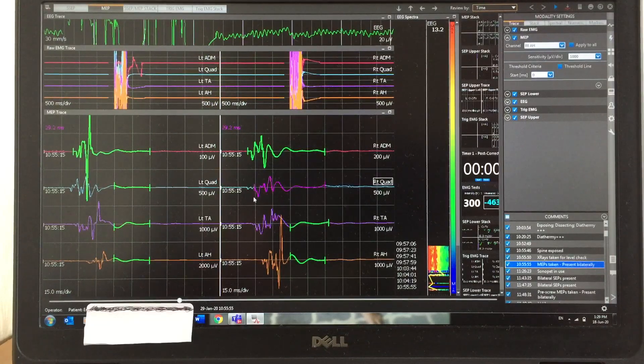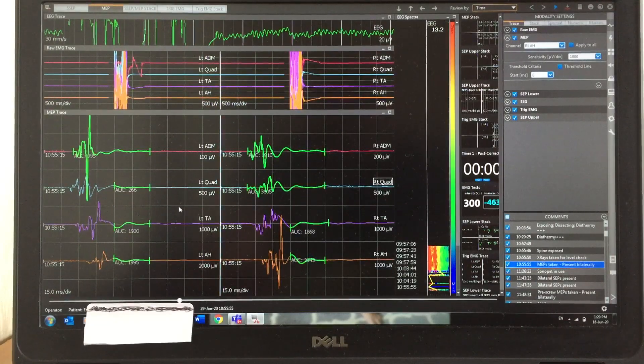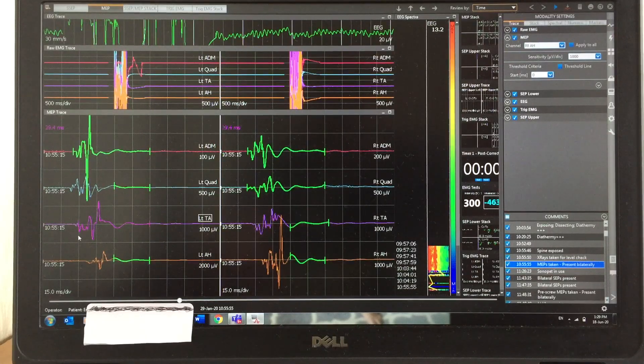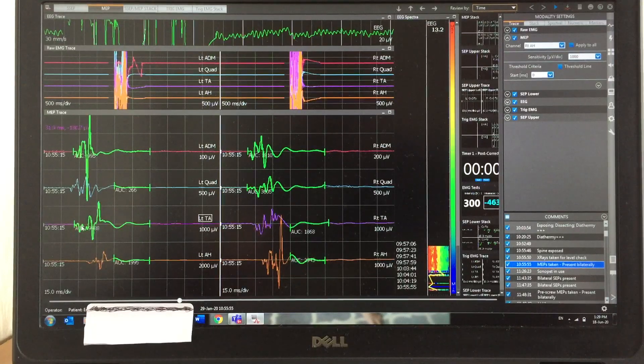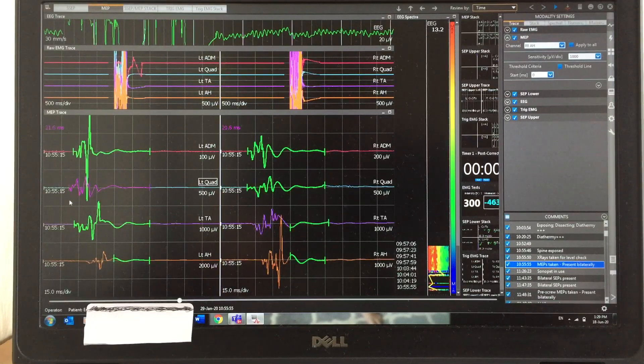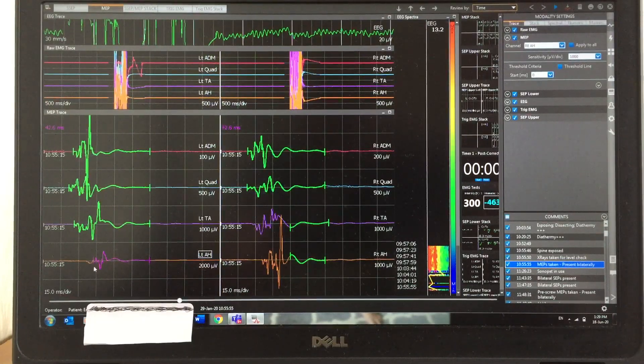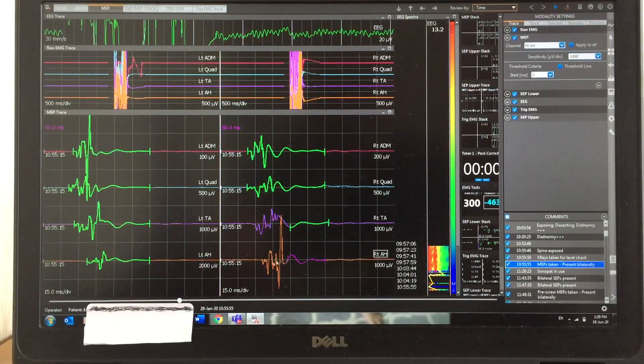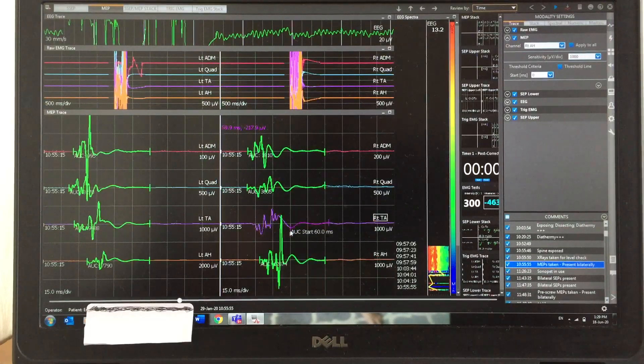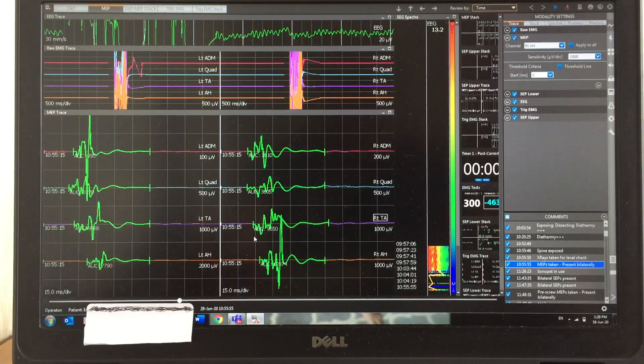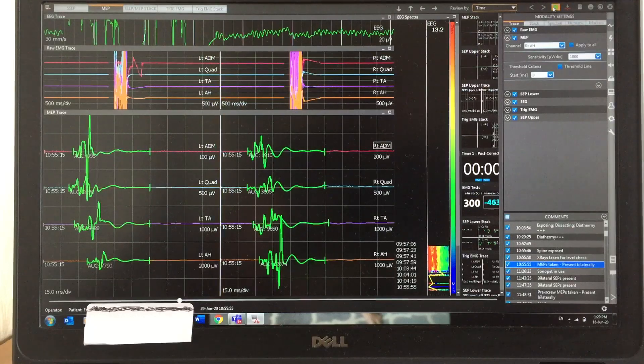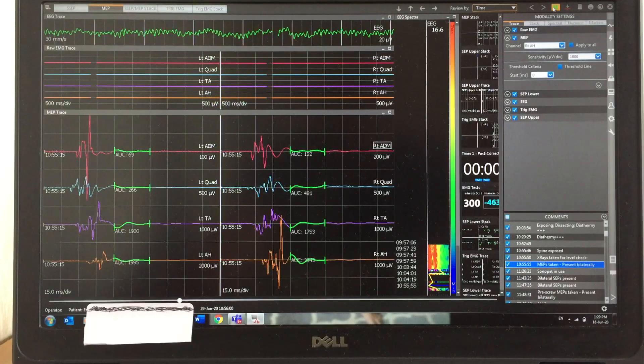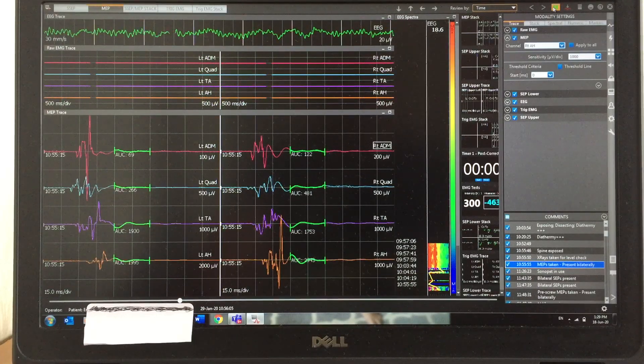We can highlight—the highlighted one is the response. It's up to you if you want to highlight, or you can just leave it because you can easily find out from the morphology of the MEP response. But to show you the actual MEP responses, I'm going to highlight. Again I'm going to play and discuss the different stages.